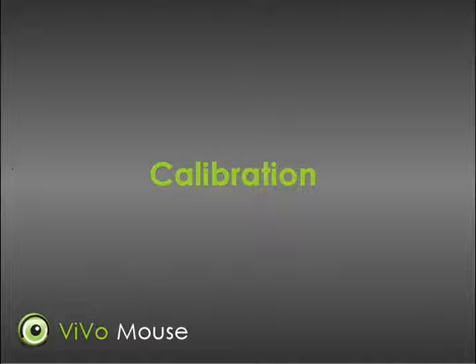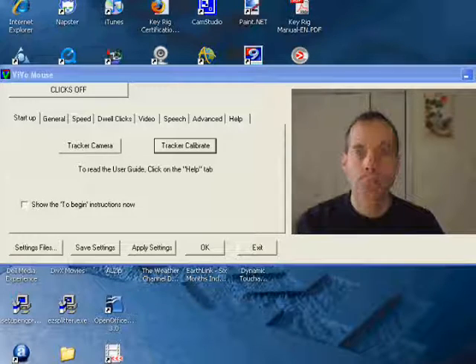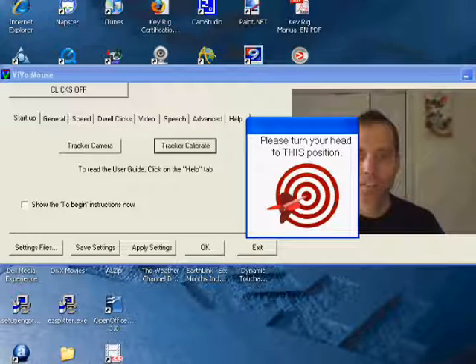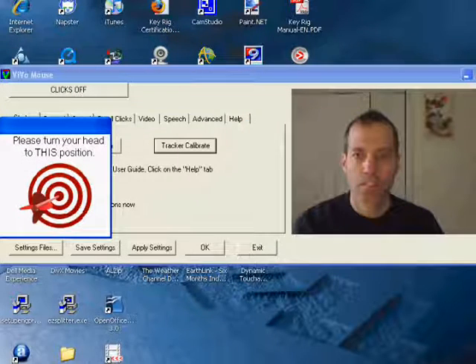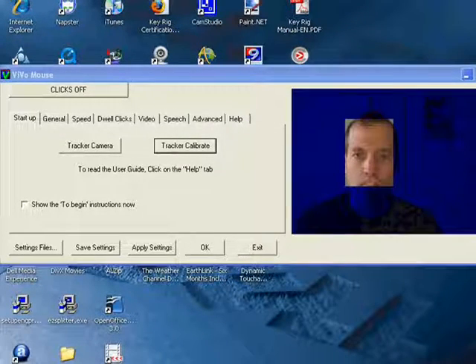To achieve this, you can say "Track" or "Calibrate," and a target appears on the screen. The target moves to the side and back again, and as you move your head to look at the target, the VivoMouse obtains the calibration information it needs.